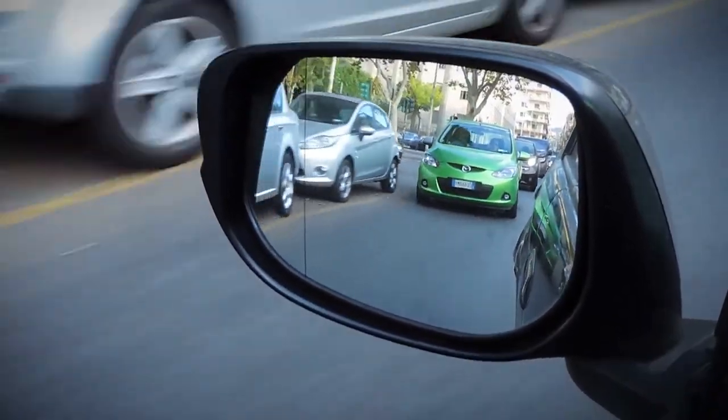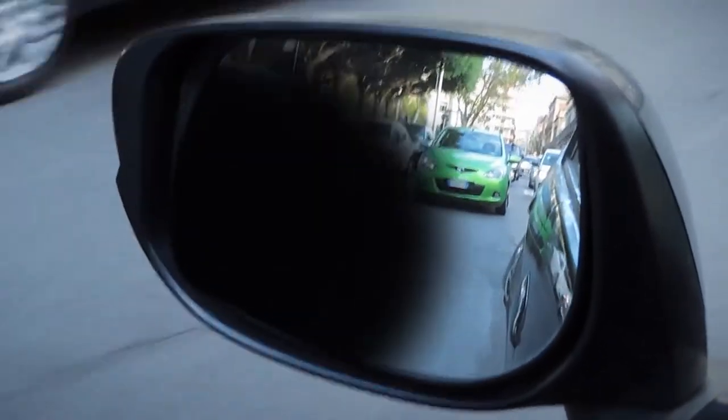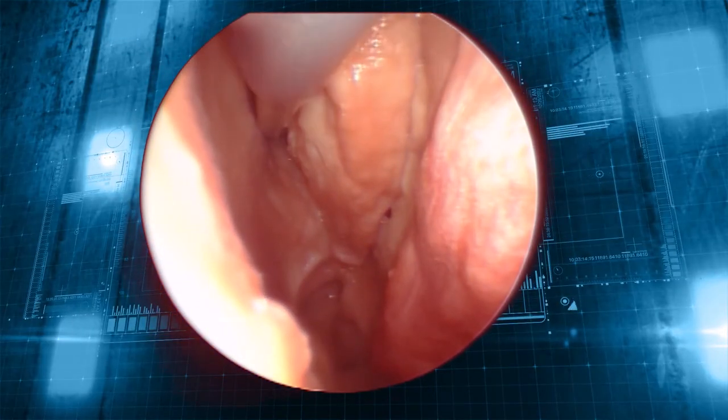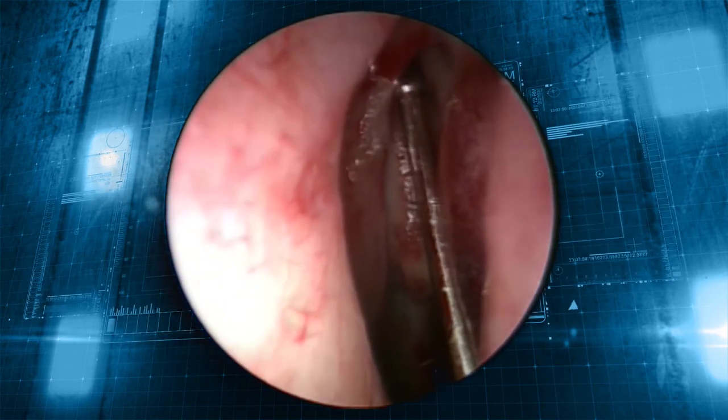Imagine you're driving with cars buzzing all around you. Having any obstruction to your view or any sort of blind spot makes this a challenge. If that blind spot becomes bigger and bigger, it gets extremely difficult. Device diameter has a similar impact on your field of vision during an endoscopic procedure — the smaller the device, the smaller the blind spot.